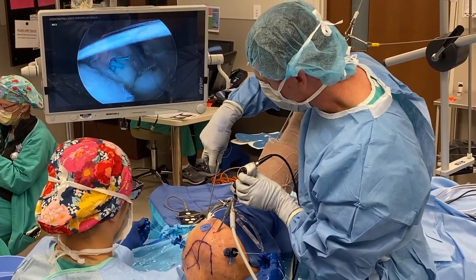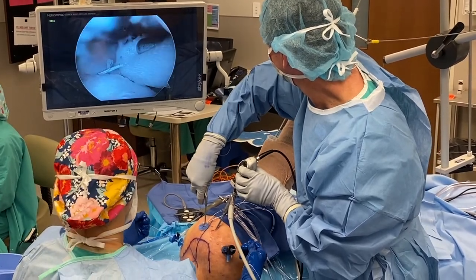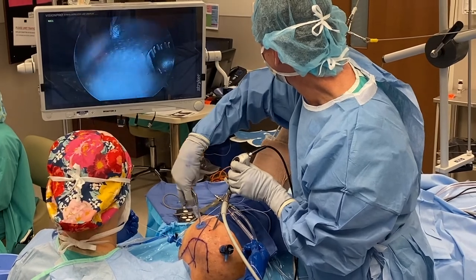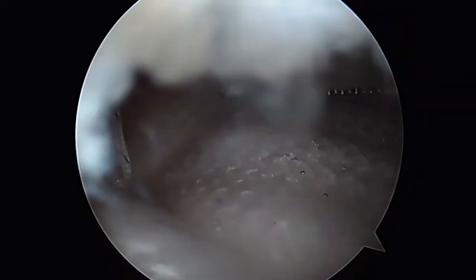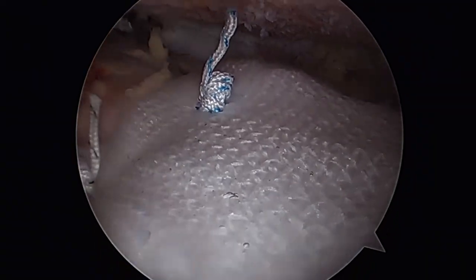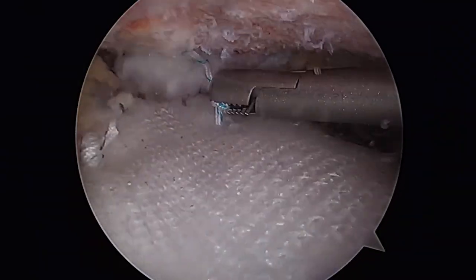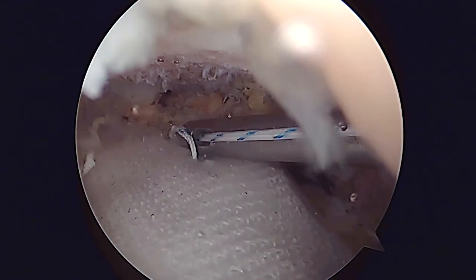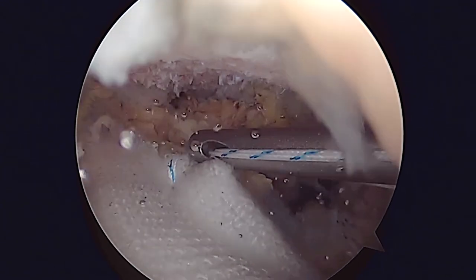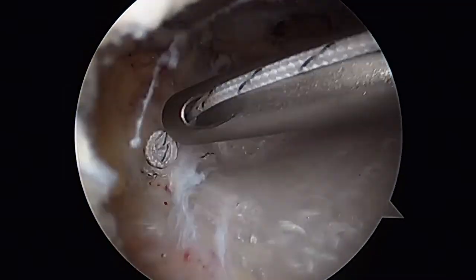Once both stick sutures are shuttled through the rotator cuff native tissue, the graft is brought into the subacromial space. Gently pulling the stick limbs guides the graft securely into position. You can see the stick knots sitting on top of the graft and understand how they can be used to control and pull the graft into the shoulder. Once the graft is in the shoulder, we can grab the stick knots and tie them down as standard knots. Tying through the anterolateral portal, we tie first the anterior, then the posterior stick knot down, and this will fix the graft securely to the underlying rotator cuff.